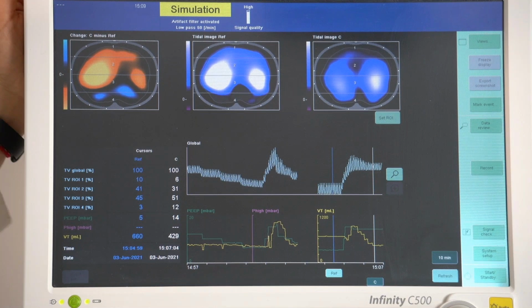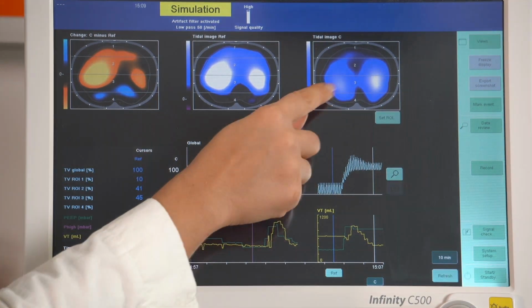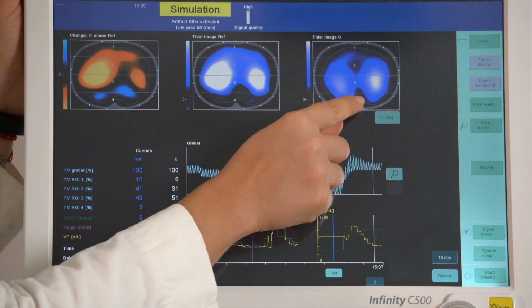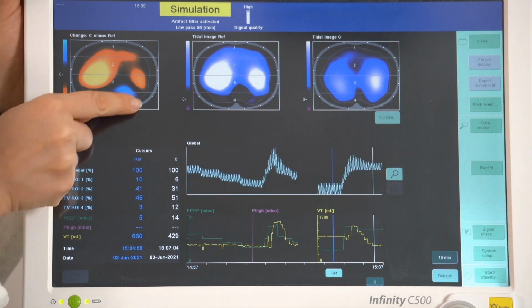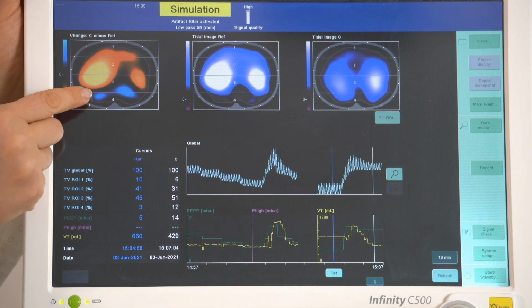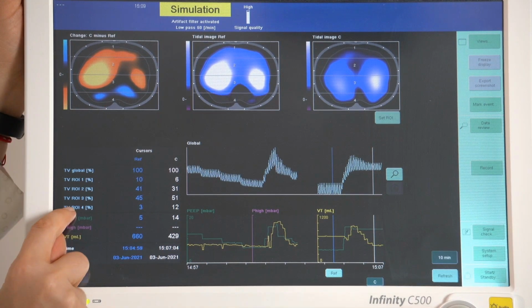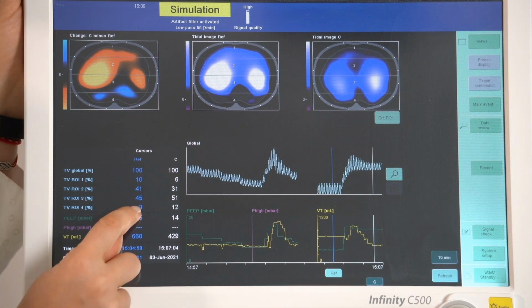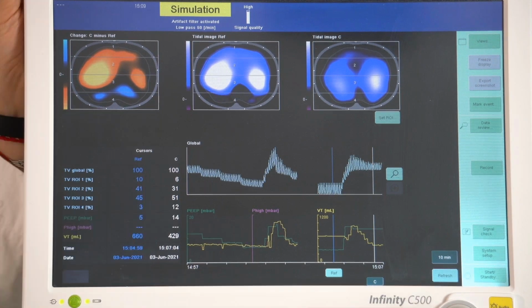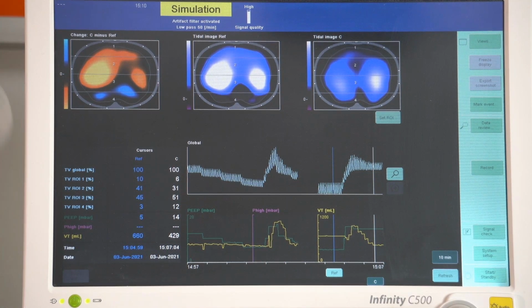And we can see here that, even on the cursor, image 1, their ventilation has improved. We also see that the ventilation in this dorsal area has also increased. And if we now compare the tidal ventilation distribution in the region of interest 4, we went from 3% to 12%. So that means our patient has responded positively to the recruitment maneuver.